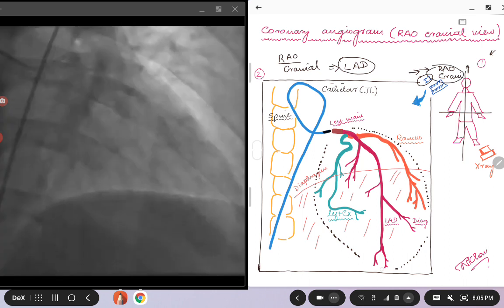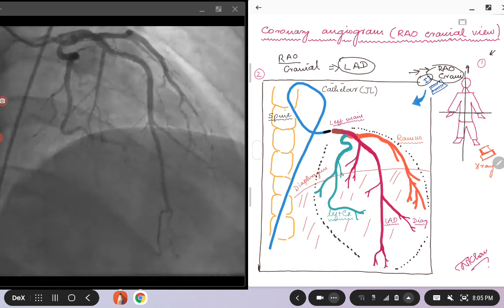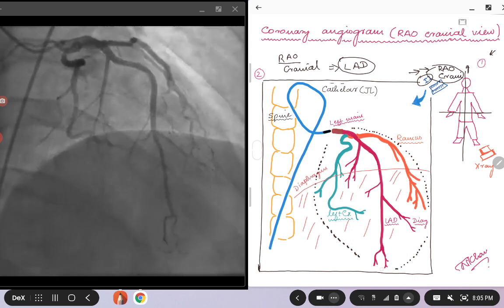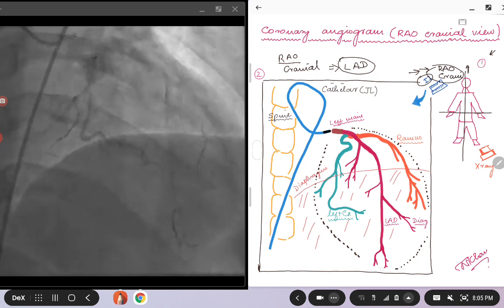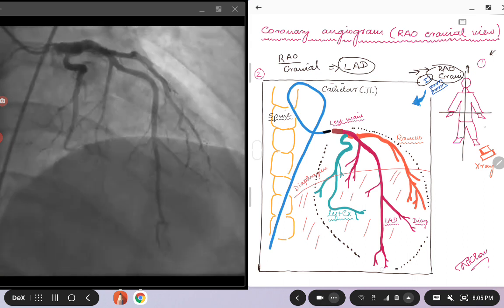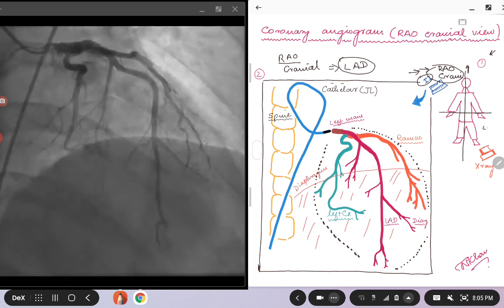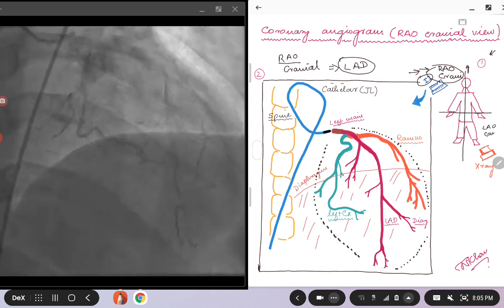Another thing, as I always stress, is you have to know your X-ray will be in the opposite direction to your image or where your II is. So in this case, the X-ray source is in the LAO caudal position.